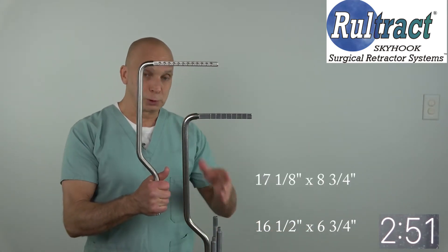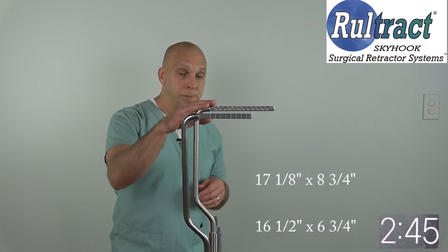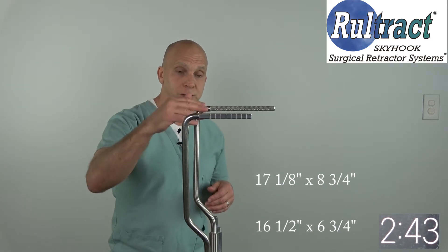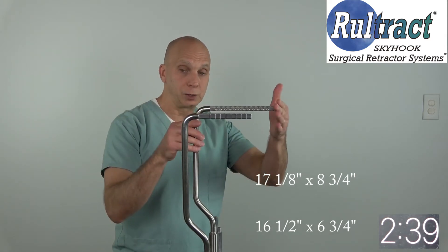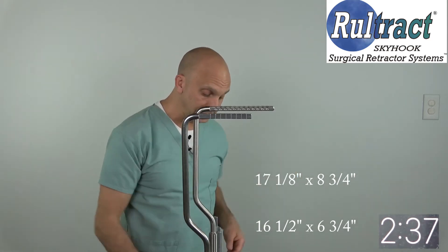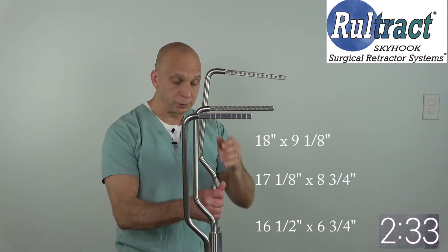Next is option number two, which is a little bit newer of a top post, and you may have some of these as well. You can see the difference here with option number two — it is a little bit higher than one, and it also reaches further out over the table.